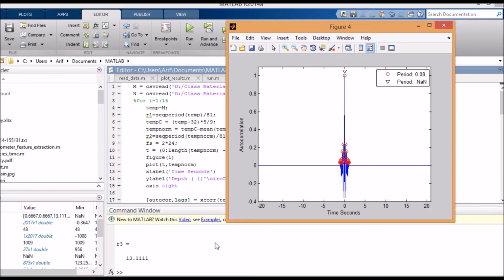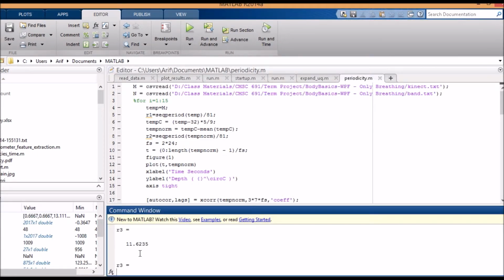Now we can see that for the first case the Kinect sensor is providing 11.6 as the breathing count in our experiment, and the Microsoft Band provided respiration rate is 13.1. So here we can see that there's almost a 1.5 count difference in the accuracy.